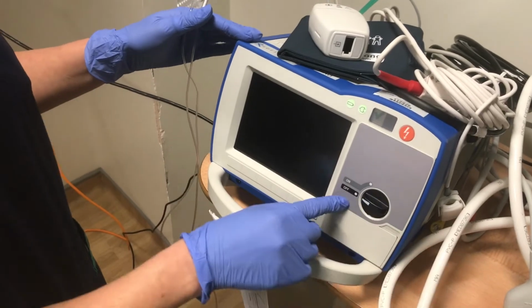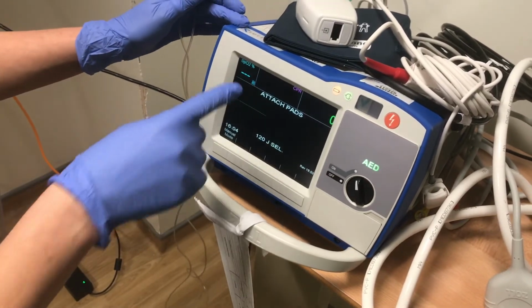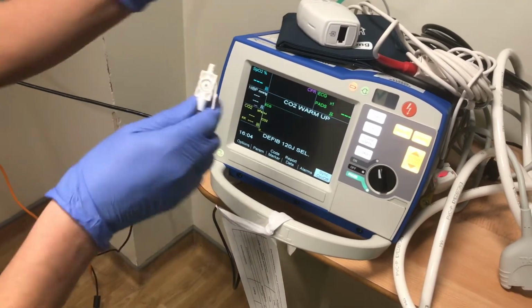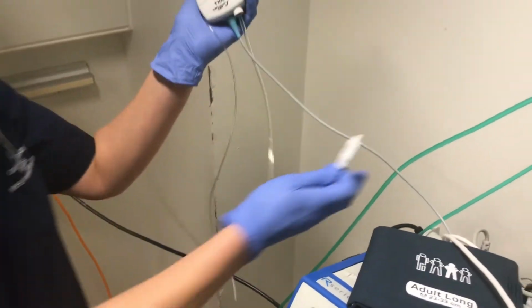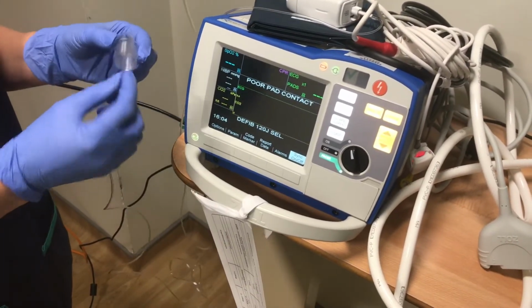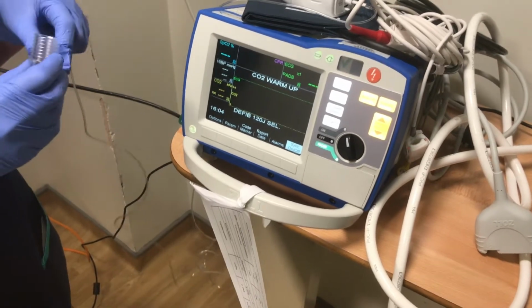When you initially turn the machine on, you have an on-off button. Turn it on, it will default into AED mode. Attach pads. To actually get it to the monitoring, you will need to press manual mode, and then that will give you the monitoring area. The CO2 fits into this module that's attached from the back, and it will just slide in like that, and it will have a CO2 monitoring warming up, and then you will be able to attach that appropriately as per the old machine.